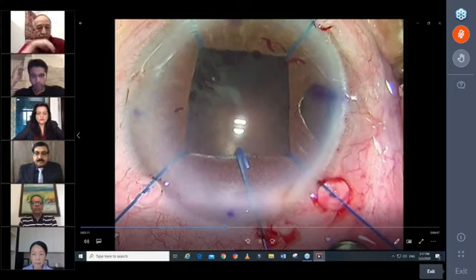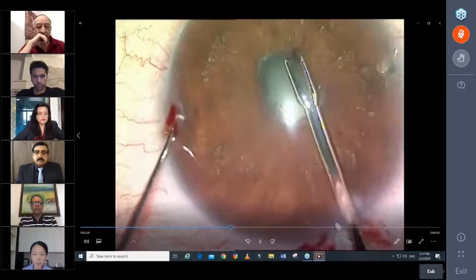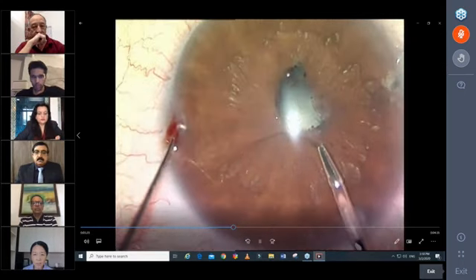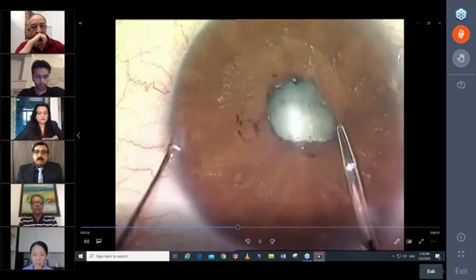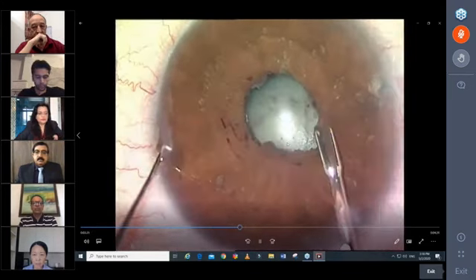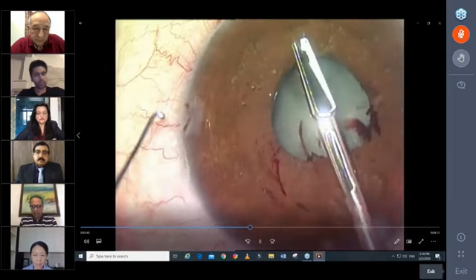If you see a membrane, you can see a PI created here. This was totally occluded. I used just a Kawai forceps, which is micro forceps for capsular access, and I just pick very carefully initially at the edge of the pupil, and then once you lift off the pupil, you then grab the membrane. All right, be very careful what you're grabbing so that you don't grab and tear iris. There may be a bit of bleeding, but that's okay as long as the patient's not on anticoagulants. And then you can snip off these frills so that you have a nice round pupil at the end after your surgery.